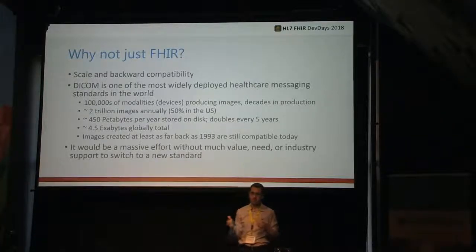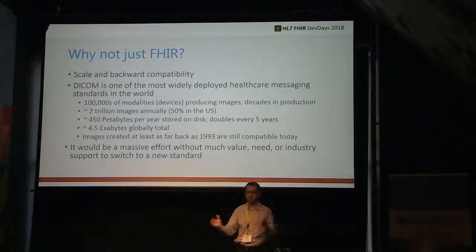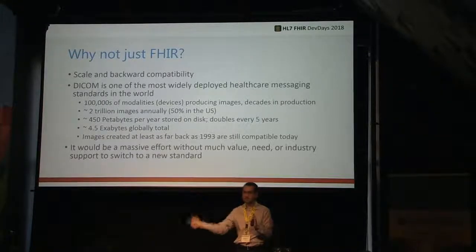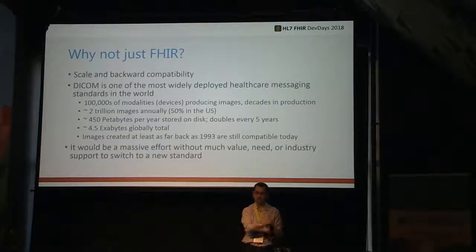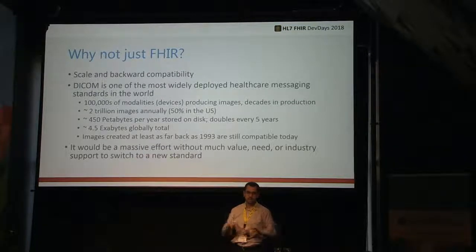In fact, if you look at the evolution of DICOM, so going from DICOM to DICOMweb, DICOMweb didn't go back to the drawing board like FHIR did, right? DICOMweb is actually backwards compatible with DICOM. It's built on top of it. So it's an evolution, not a revolution, because you cannot actually afford to do that with DICOM. You can't just say, hey, all that information, garbage, we start new.